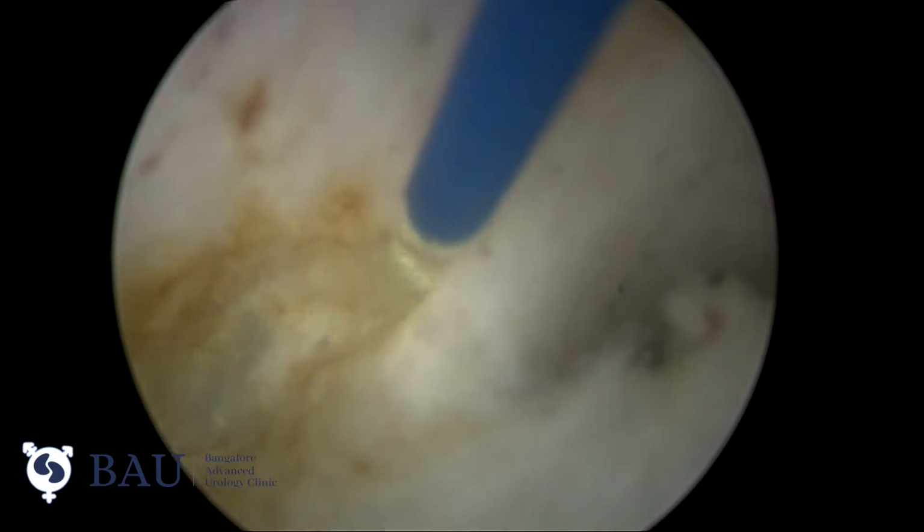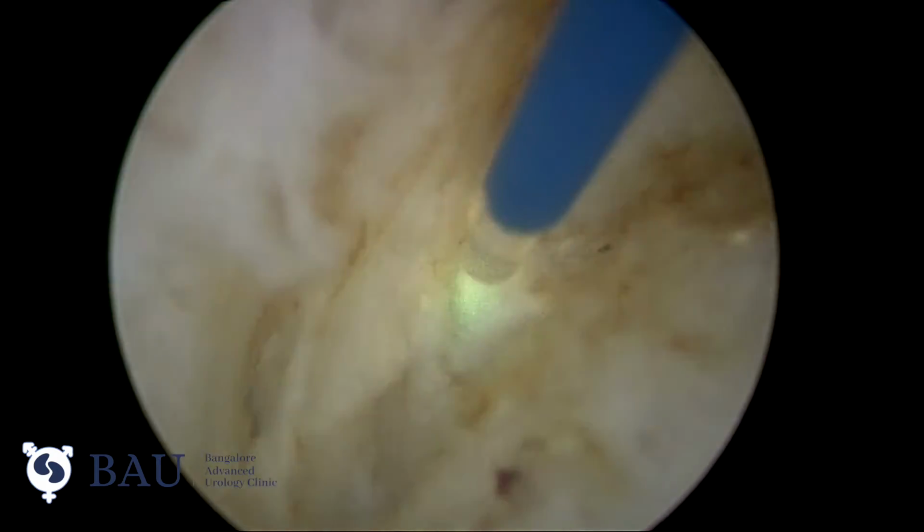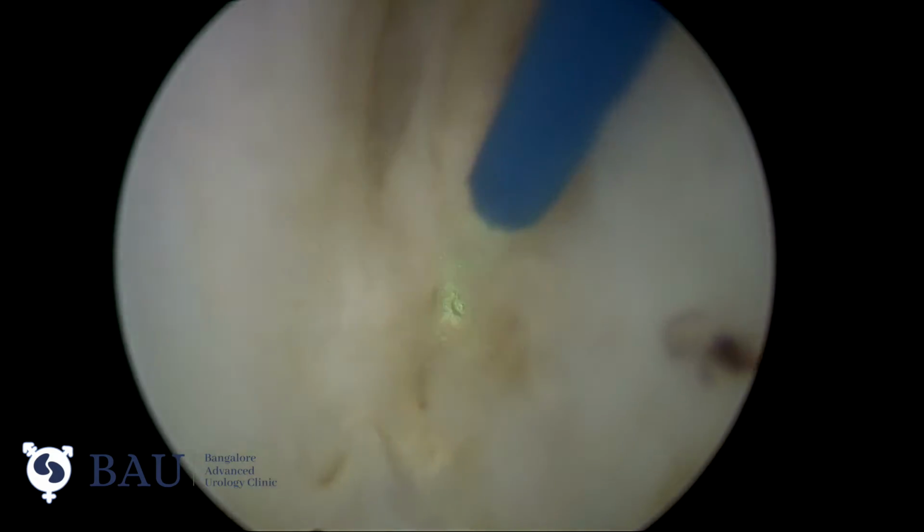As soon as we enter a little bit inside the prostatic tissue, we can see the charring. But better to be near to the lobe rather than the capsule.